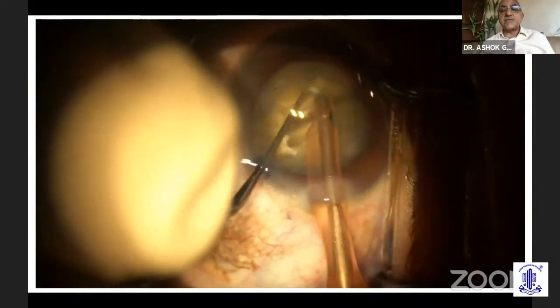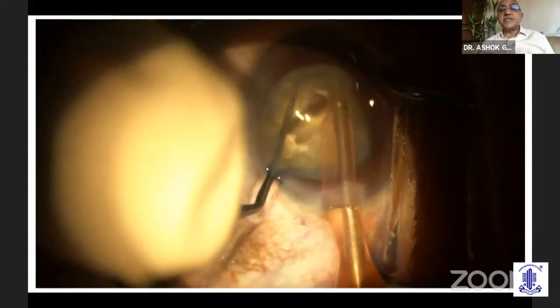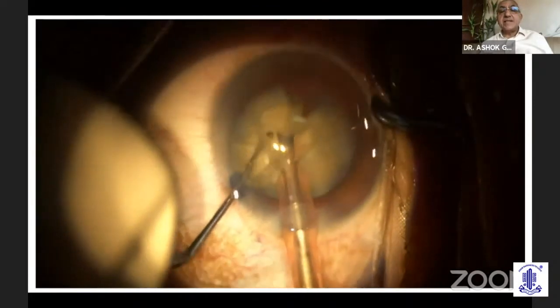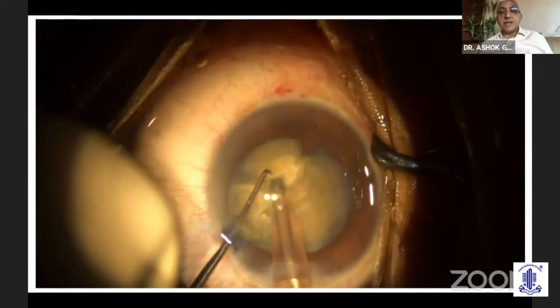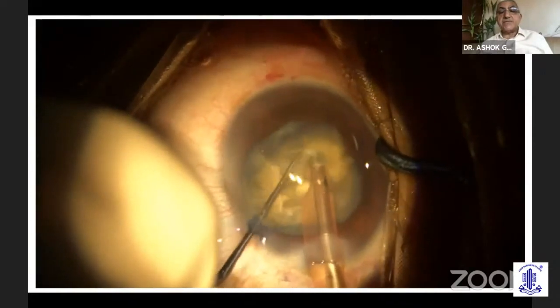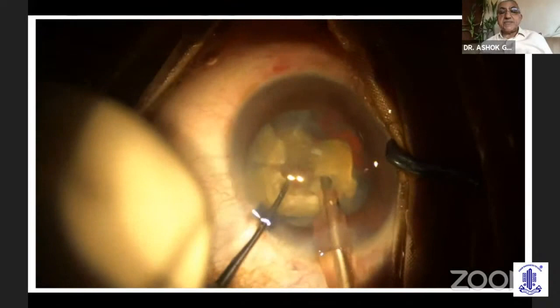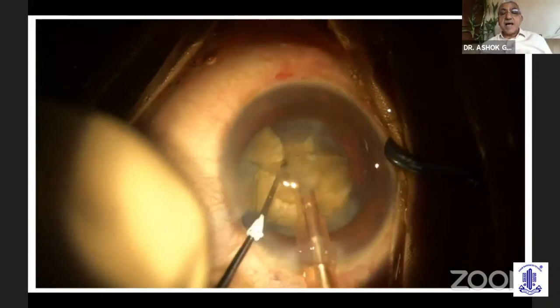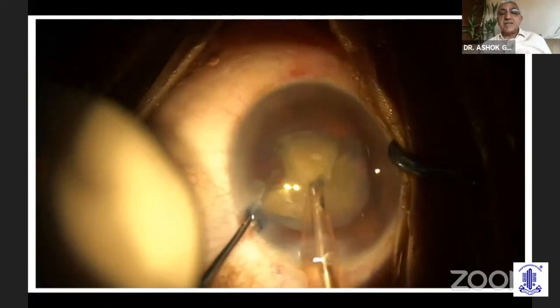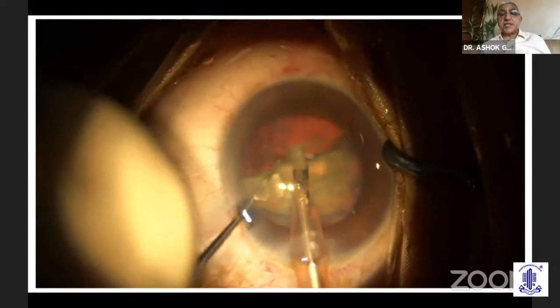I'm all the time checking for any signs of instability, a sideways shift or difficulty in rotation. And as you see, my forces are being used on the right side with my phaco probe, and I'm trying to minimize the force that I use for separation with my vertical chop on the left side where the break is. And here, as you can see, I'm lifting it forward. I'm going to emulsify the pieces in the iris plane. And I started debulking from the beginning rather than leaving the pieces in. I'm lifting off the pieces to debulk and reduce the intralenticular pressure.